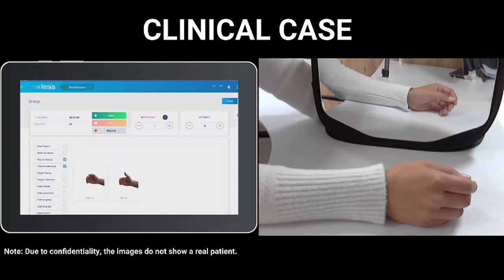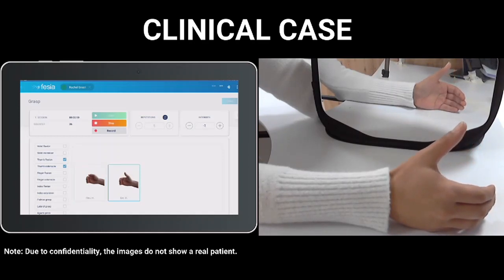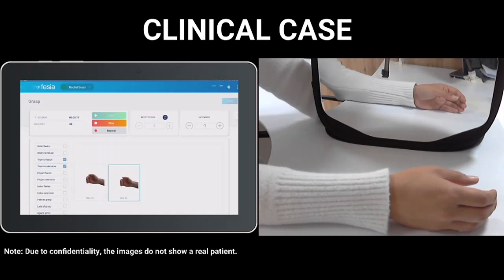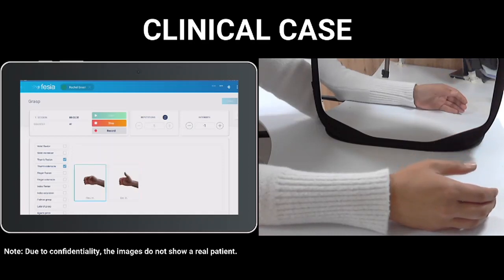And what I am going to do at the same time, I am going to select the same previous movements, which were the thumb flexion and extension, and I am going to ask her to produce the same movement with the non-paretic hand at the same moment. Okay, let's start now. I will increase the intensity. And now the input arriving to the CNS is double. The first one, she's seeing her paretic arm producing the movement, but at the same time, she's producing the same movement in the non-paretic arm, and this is very interesting.